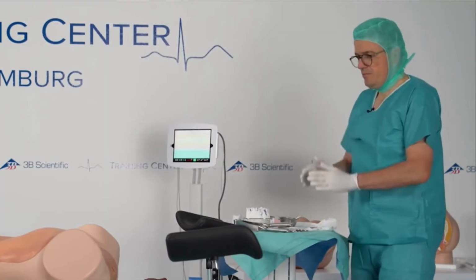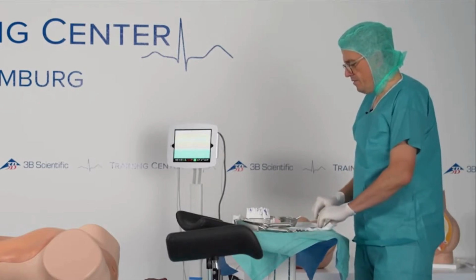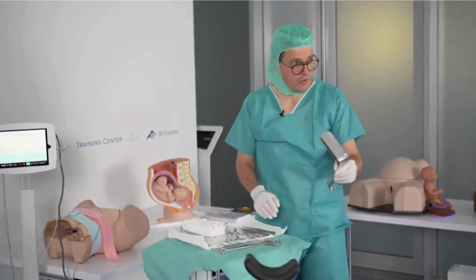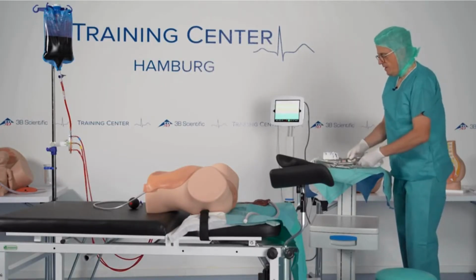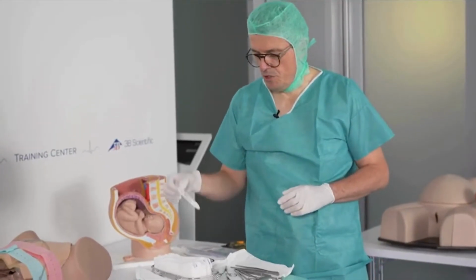Tears, we expect a slight vaginal tear. Now she already prepared specula to check for cervical lesions and the instruments to check for the cervix and the vagina. And also we have sutures prepared.